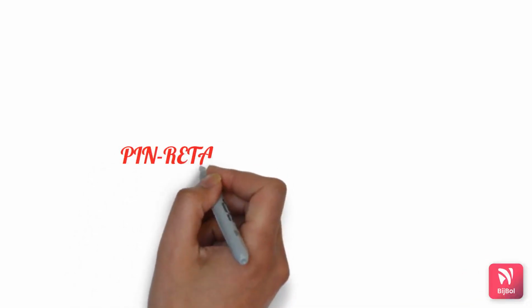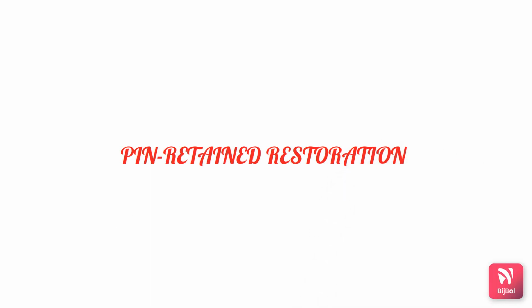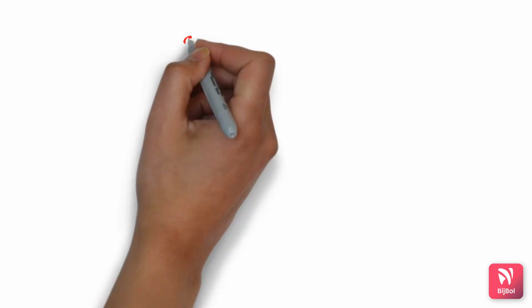Now we'll see pin retained restorations. What are pin retained restorations? It is any restoration which requires the placement of one or more pins in the dentin so as to provide adequate resistance and retention form to the restoration.